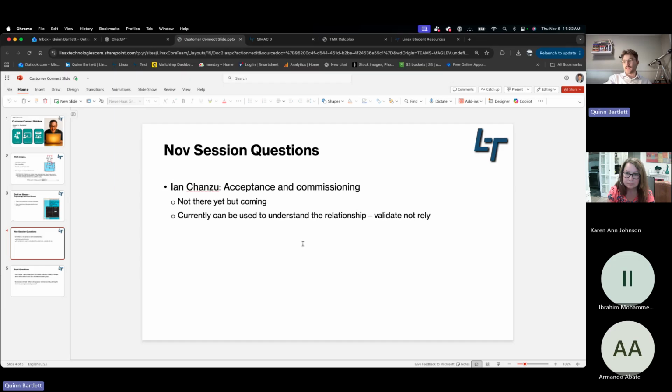But we had a question from Ian this session, just asking about acceptance and commissioning PDDs, like using Simac to get acceptance and commissioning PDDs. The answer is, yeah, we're not quite there yet, but we're coming. You can absolutely use Simac for acceptance and commissioning data, but right now it's only to validate and not rely on, or to try to predict and not rely on. Our models aren't accurate enough to say that the physical changes you make are going to be 100% what a real linac would reflect. But we are very confident we're in a small percentage error of 3 to 5%.